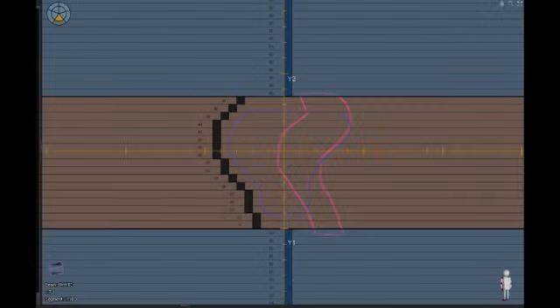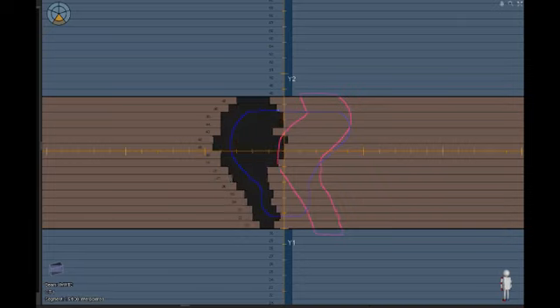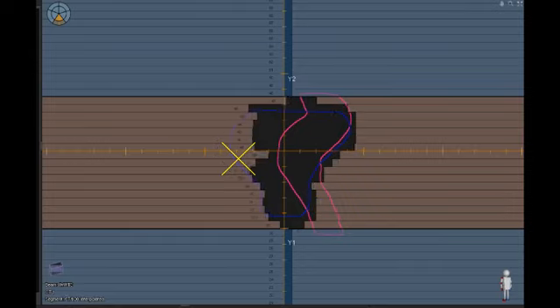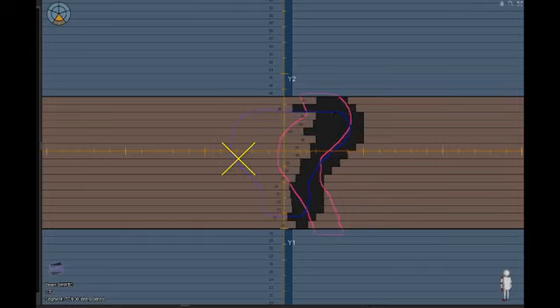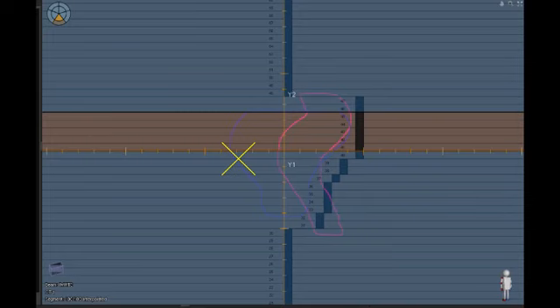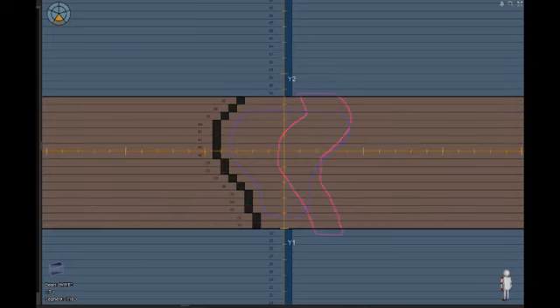So to motivate this, let's look at this. The MLC as it slides across, and let's look at this point, the X, inside the PTV. Watch how the leaves move. And you'll see that for most of the treatment, that particular point is covered. And that's true of actually every point in the PTV. And so the result is that the MLC is not very efficient at delivering dose. It's quote-unquote off for most of the treatment. So that's one motivation for using compensators. So let's look at how those work.